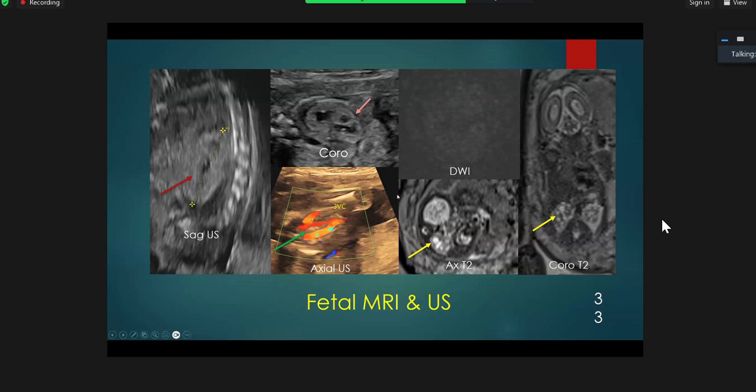You can quite clearly see there is no bladder, and you get a finer detail look on the corticomedullary differentiation is decreased by ultrasound. A few cortical cysts, and here you can see all these more cystic cortical lesions. And the question was this multicystic versus calyceal dilatation?